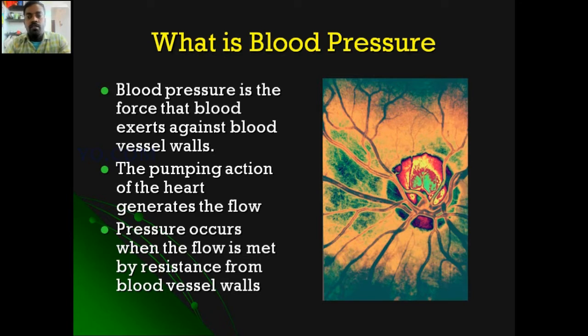Consider a water pipe. The water is normally flowing. If you just press the pipe, what will happen? The pressure increases in the pipe. The same concept applies: the heart is pumping and the blood is flowing through the vessels. When we disturb the vessels, the blood pressure increases in those particular vessels. Based on this concept, we measure the actual blood pressure in our body.